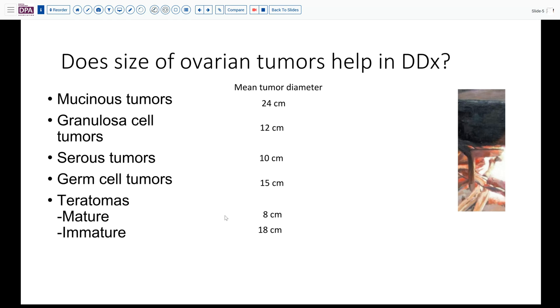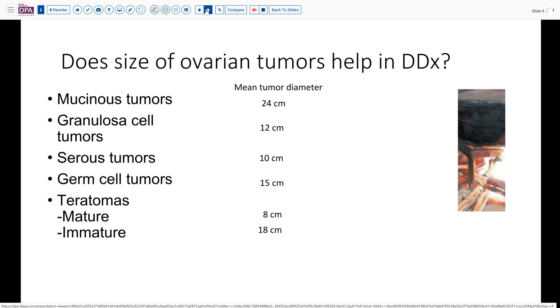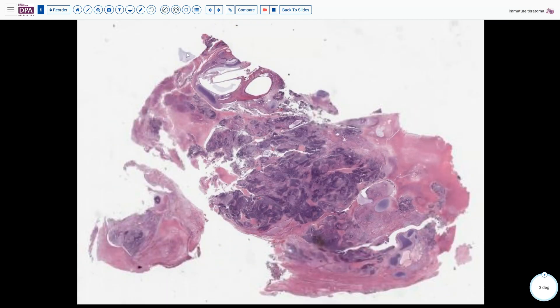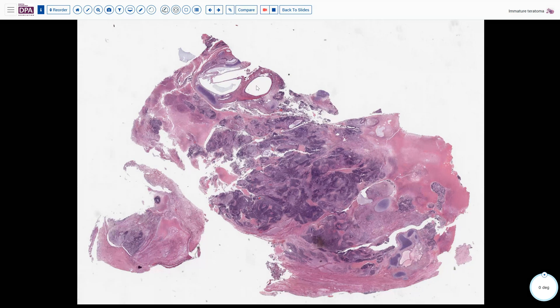Teratomas also tend to be of reasonable size. Of note, a larger tumor in a teratoma should raise consideration for an immature teratoma. We were certainly well above that threshold. Even on the contralateral side, our tumor was about eight centimeters, so consideration should have been given to exhaustive sectioning. When the final tissues were submitted and multiple sections examined, we had four or five slides that looked very much like this.